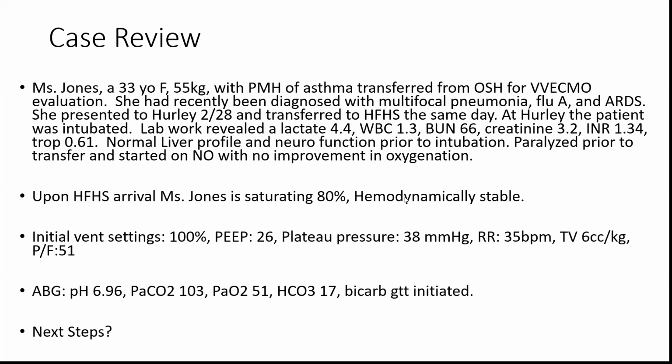Okay, you can come down on tidal volume. You want to come down to 4, all right? Ultra protective. I like your ultra protective vent settings. Yeah, so the thing here, unless you're in pod 4 with pulmonary hypertension, we don't use nitric oxide here for our ARDS patients. And I know there are camps for that as well, but another institution may be able to offer that.